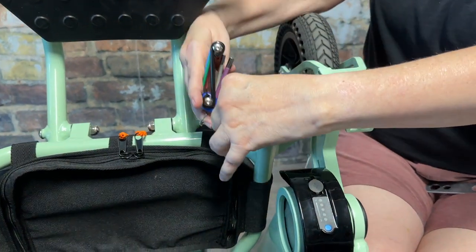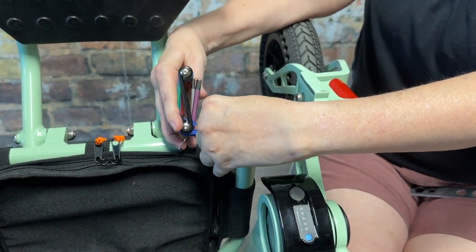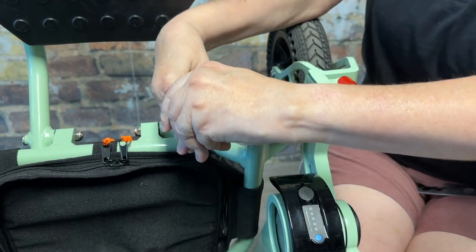Next you're going to move to the undercarriage. These three bolts are all the blue hex head.